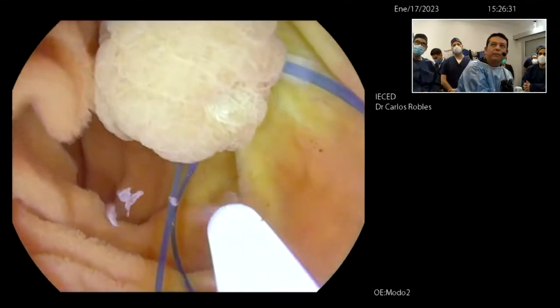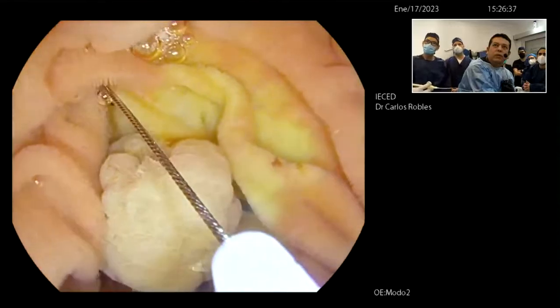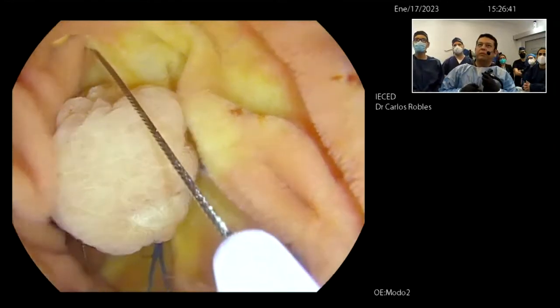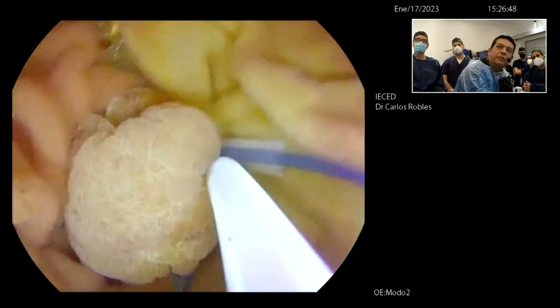Open. And you see, underwater, it's easier to do anything here. Close slowly, please. One moment, open. So all the maneuverability is a little bit easier.